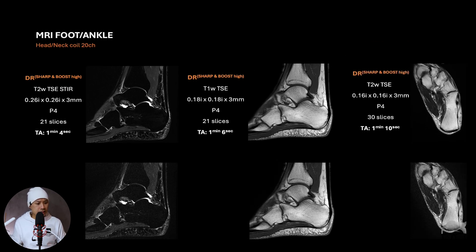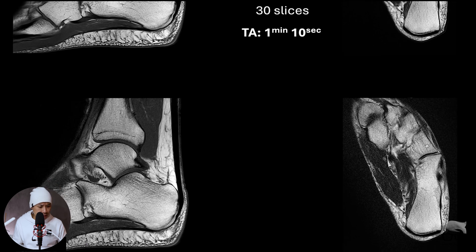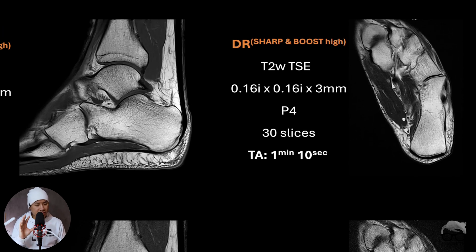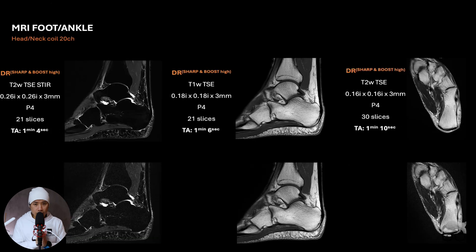The last one is the T2 sequence — and it's amazing. The resolution is 0.16mm interpolated in that specific coil, 30 slices, covers a lot, and takes around one minute and ten seconds. This one is at its peak because I can see there's a lot of noise in the image. Maybe I could push it a little more, but not much — it's already at its peak.